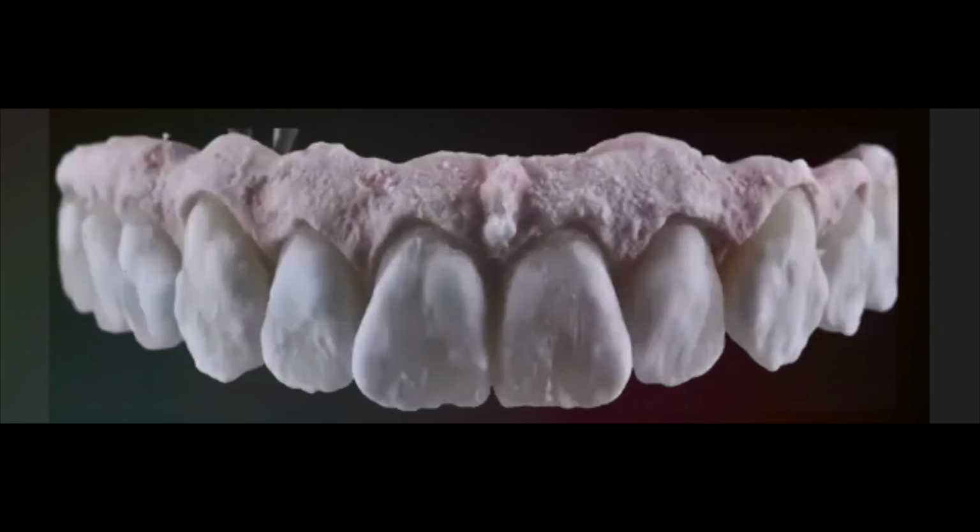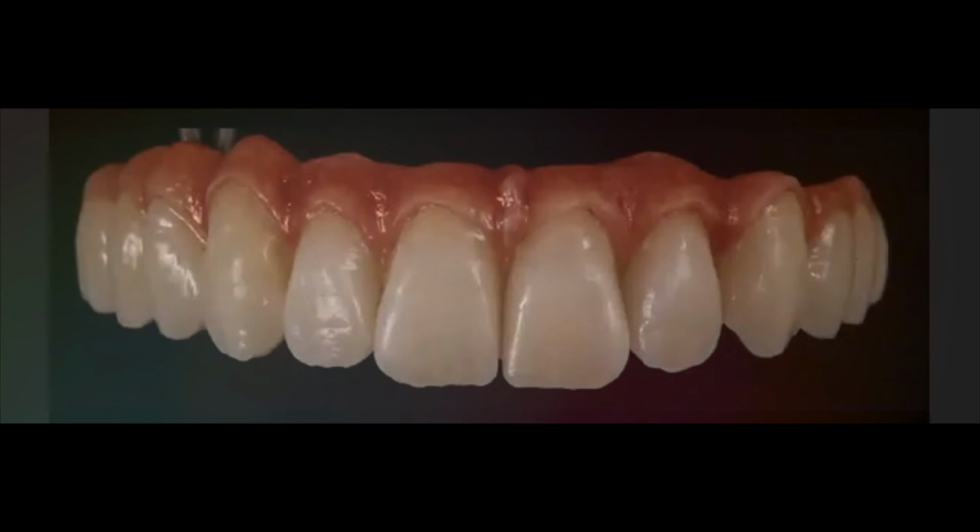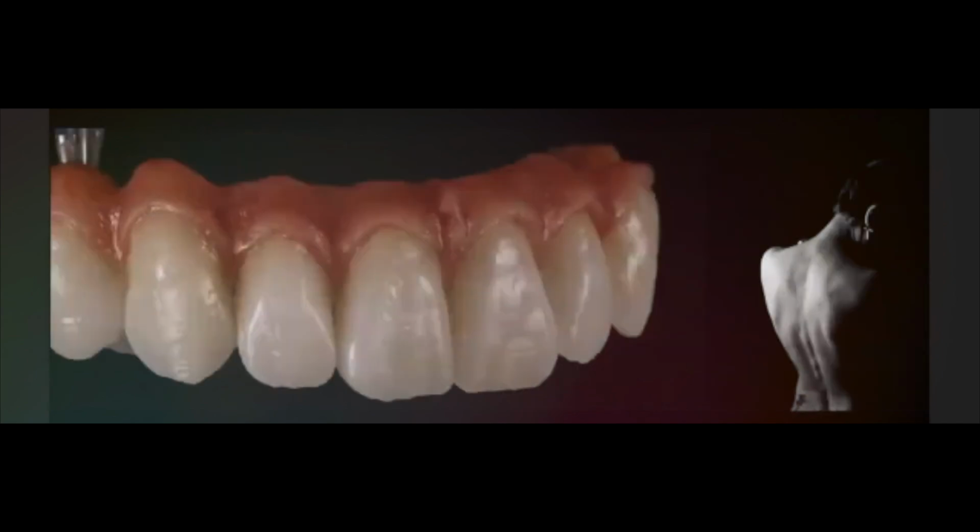So when we have big zirconia cases like this, we need to be careful, not only to apply aesthetics, not only function, but we need to be careful how we treat the materials: bake schedules, time, of course, morphology, surface texture, shape, color of pink aesthetic, and layering of pink aesthetic and white.